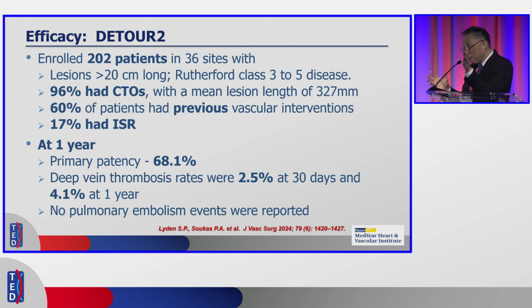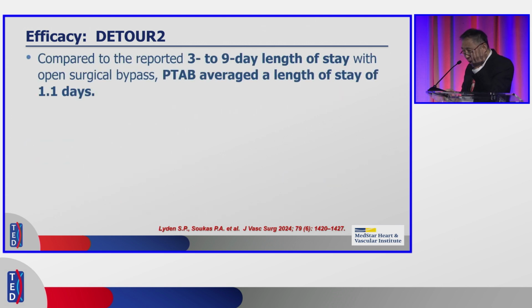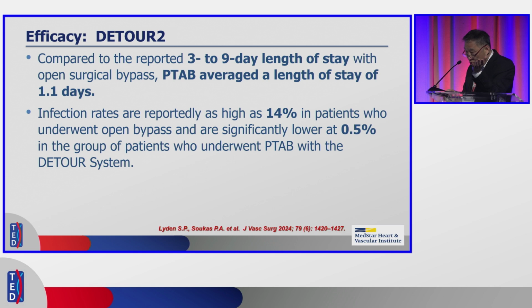And it calls into question, because we know very well from our surgical colleagues, if you do an EPTFE grafting, the long-term results are not that great, okay? So this has yet to be seen, right? And then DVT is not an issue. And then, of course, I always do this with one of my surgical colleagues, and we always say that the best thing for this is I can do the procedure, and the patient can go home actually on the same day, instead of surgery, right?